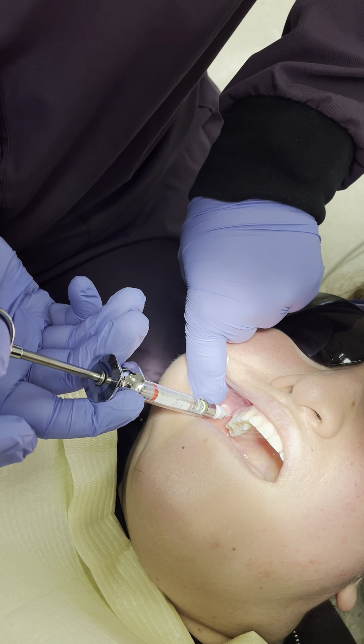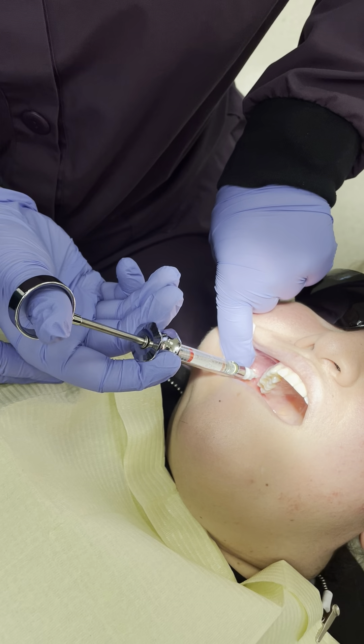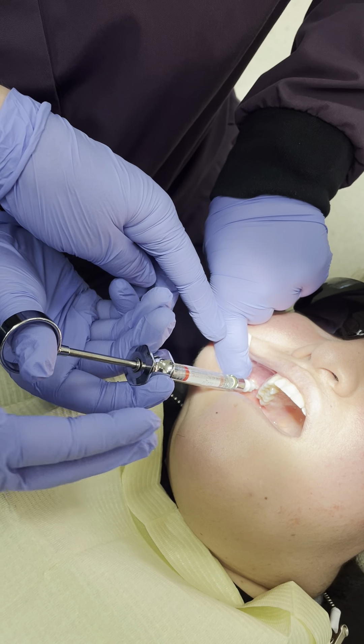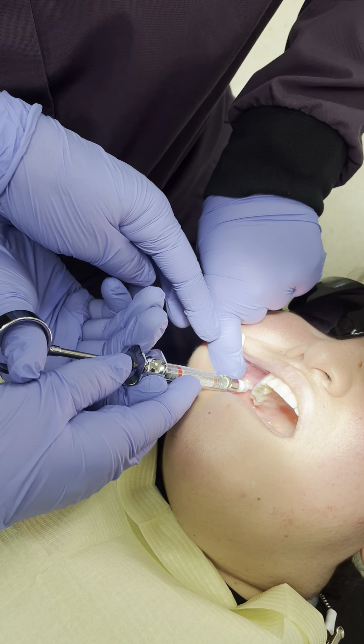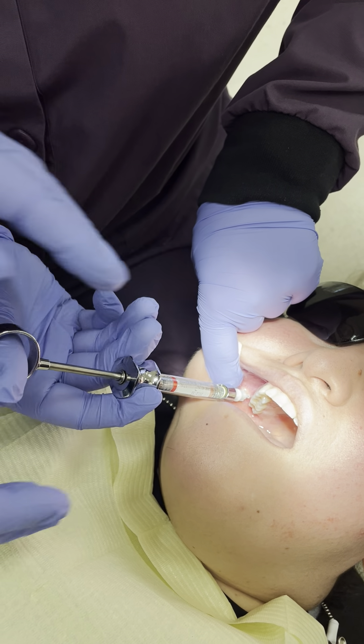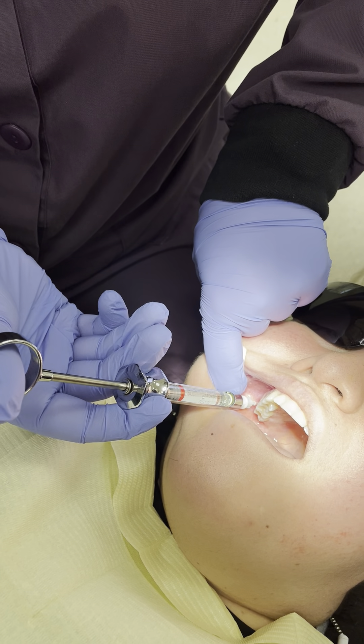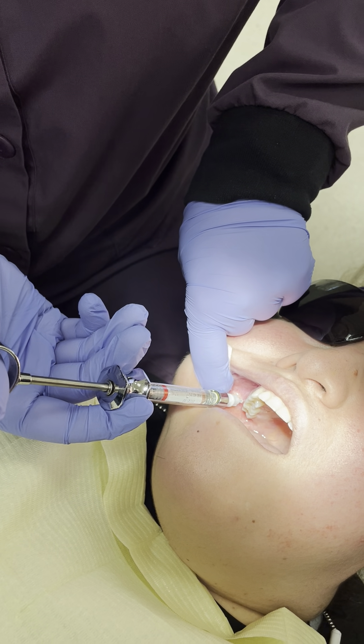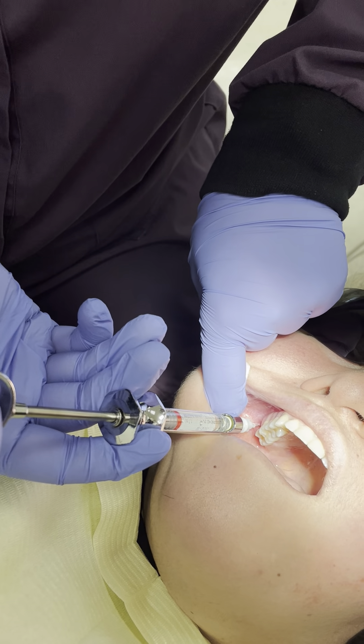She's about halfway. She's going to drop the barrel towards her shoulder so the needle goes in an upward position, and she's using her retraction finger to control the barrel so we don't have bowing of the needle. Now she's at her maximum depth and angle, which is four millimeters showing from the hub to the tissue. Maximum depth and angulation.